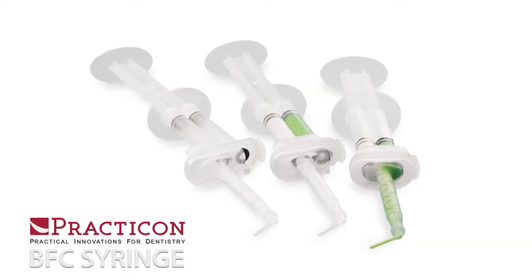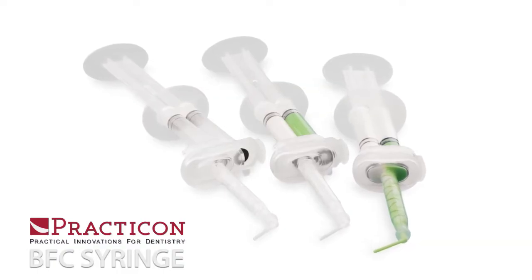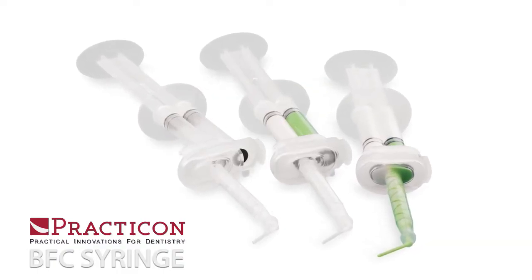Hello, I'm Dave from Practicon, here to tell you about our money-saving and time-saving BFC syringes. BFC syringes eliminate material waste and significantly reduce both prep time and cleanup time.